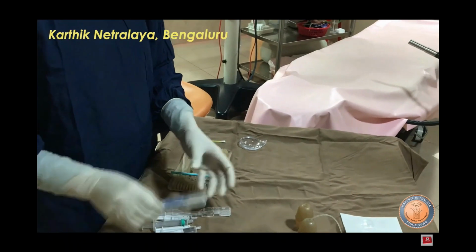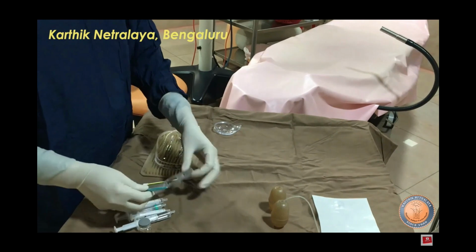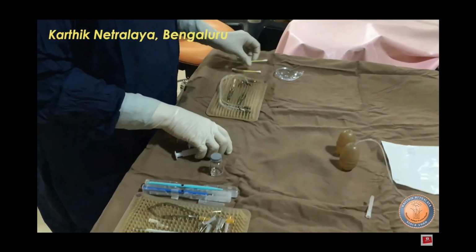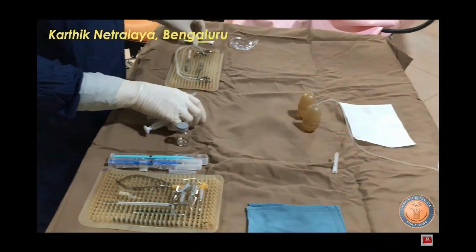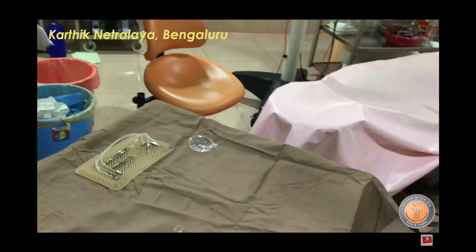The nurse will, with cotton buds, clean the sharp instruments and all the forceps as much as possible, and they are put in the appropriate polycarbonate boxes. And that's a set which is used for surgery with a couple of cannulas.